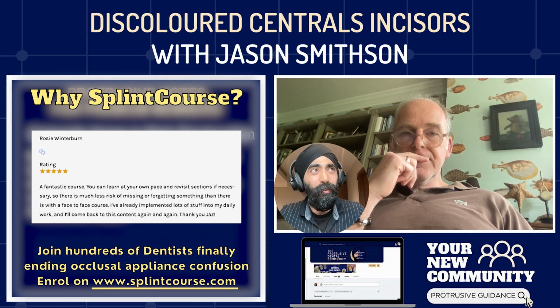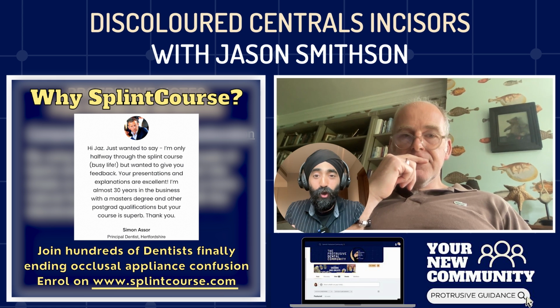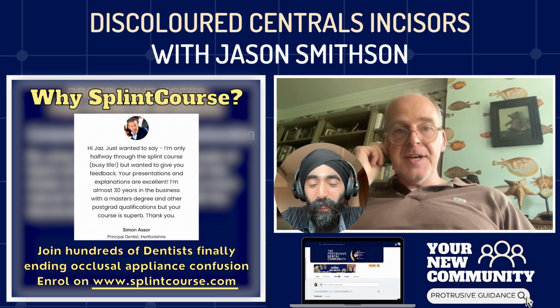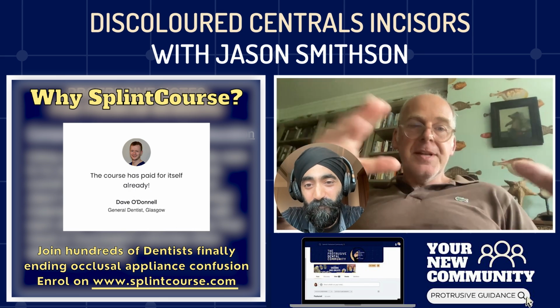It worked out well, but I don't know. I feel a little bit uneasy about doing this because I don't know how much it will affect the physical properties. Is this something that is known, or is this something that's a bit frowned upon? I've heard it before, but you've got basically two dissimilar materials mixed up, and they won't really mix. What you'll get is pools of the tint within the resin.